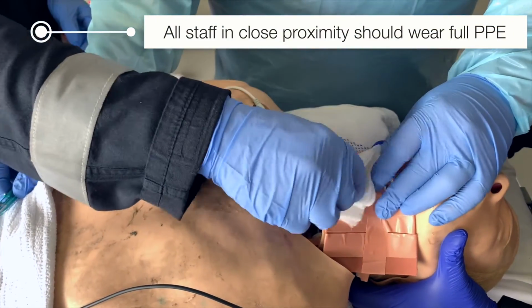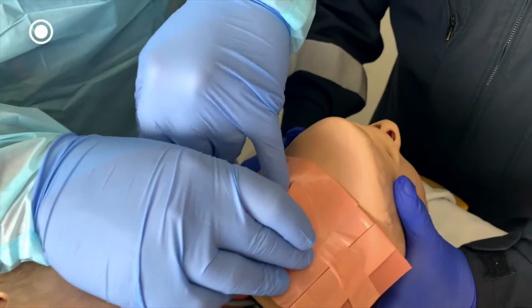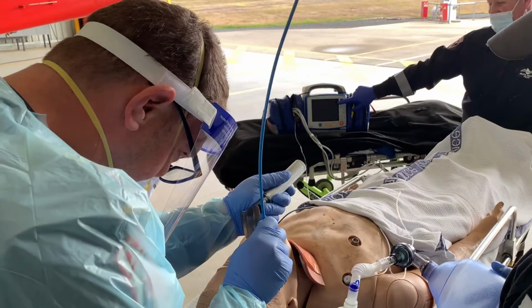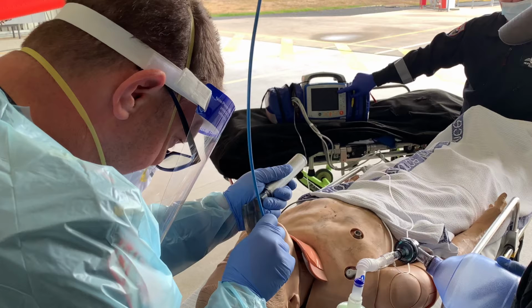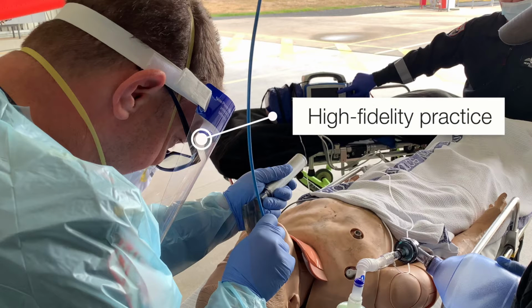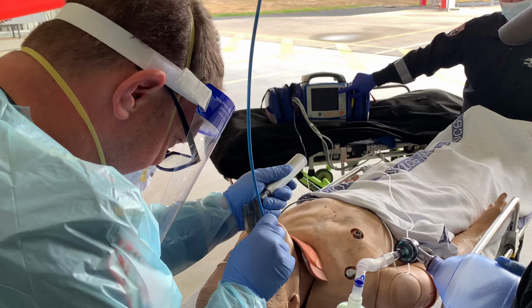Significant hemorrhage should be anticipated at the insertion site, and atomising or spraying blood is possible, particularly if the patient is attempting to breathe. A face mask and eyewear are essential in addition to the standard PPE. Practicing this skill with PPE donned is recommended to ensure familiarity with the challenges and for developing appropriate safety habits.